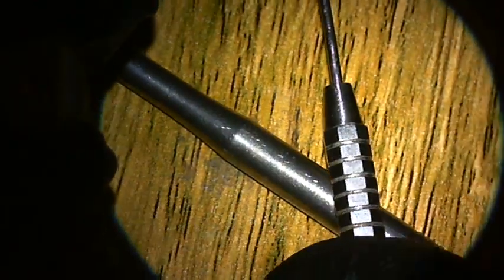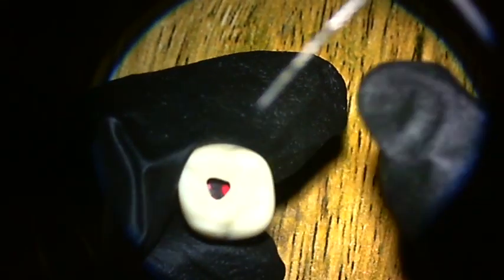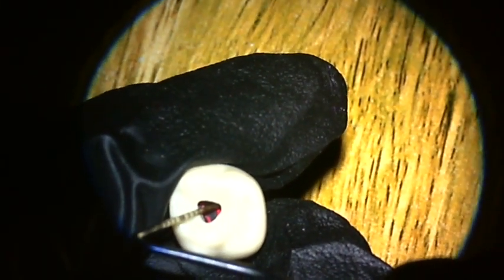Straight line access, they're gonna assess your straight line access, just like we talked in the first criterion. If you have to tilt the instrument too much laterally, if I'm going to access the distal buccal canal and I had to tilt the probe so much mesial, it means I have no straight line access.